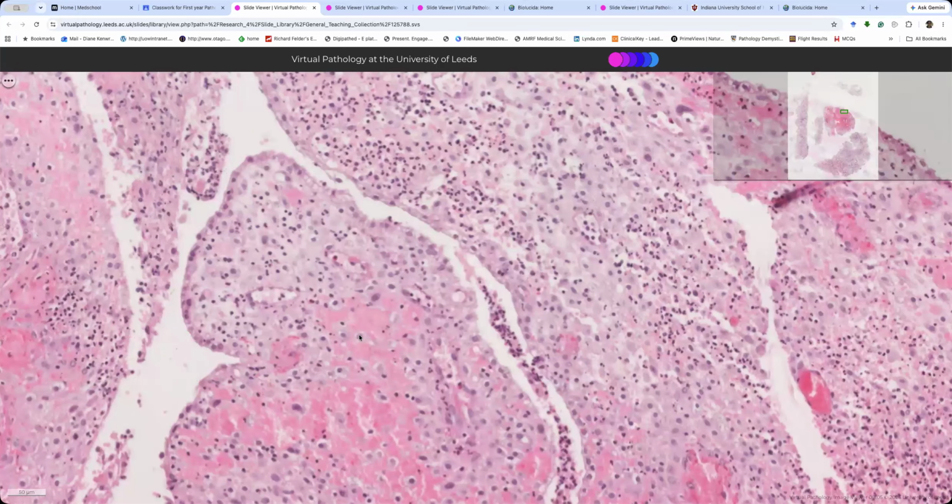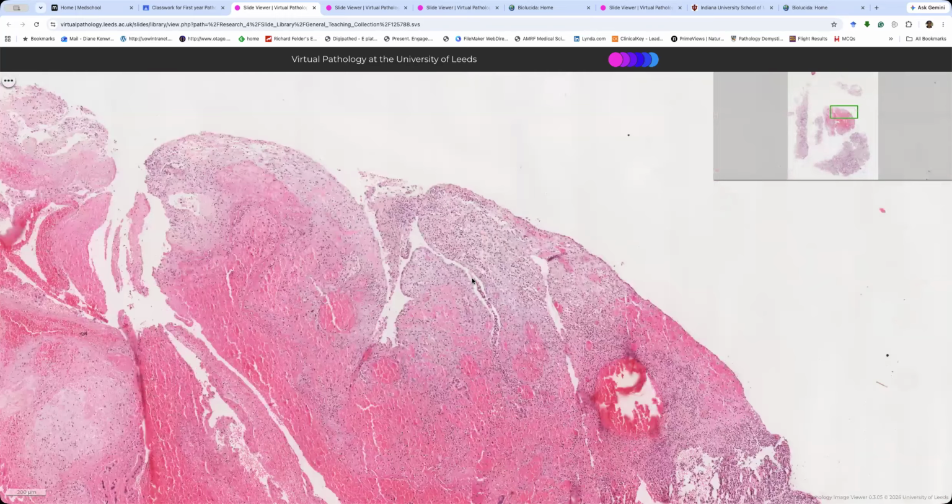So over here, I'll see if it'll clear up a bit. We've got the decidua, okay, and then even on the top here, we've got this hypersecretory change. And of course, we've got lots of inflammation because it's retained products of conception.